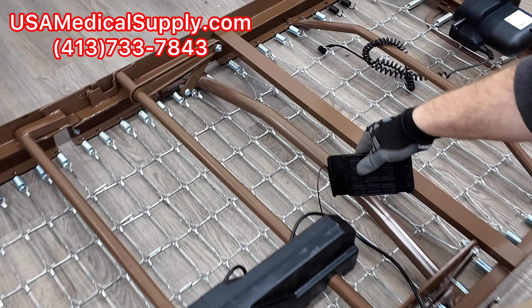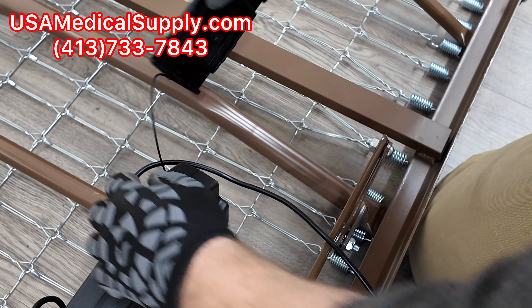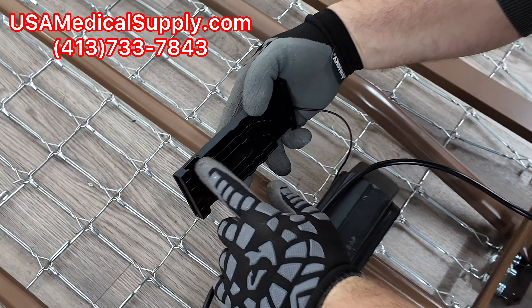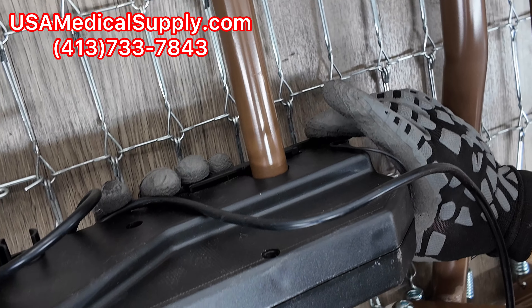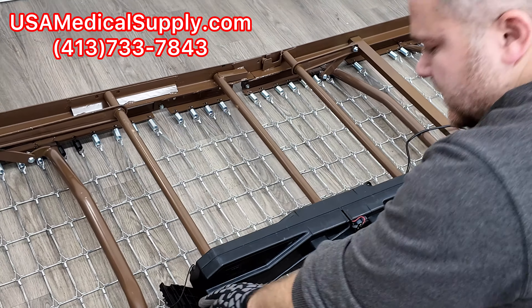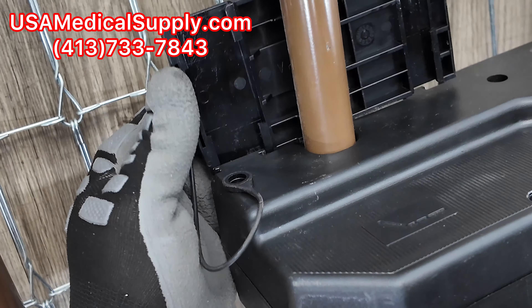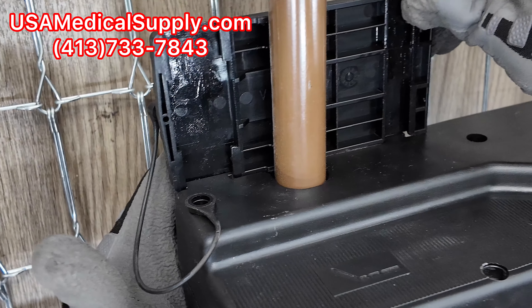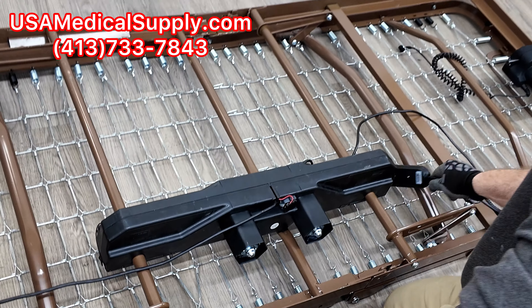Make sure your wires are not in the way, then press the motor so it seats all the way and clamps in — remember, the two bulges face outward. Now you have to put the caps that hold the motor from falling when you flip it over. These caps have slots, one narrow and one wider, so they only go in one way. Slide each one in until it clicks in place. When you turn the frame right-side up the motor won't fall down.